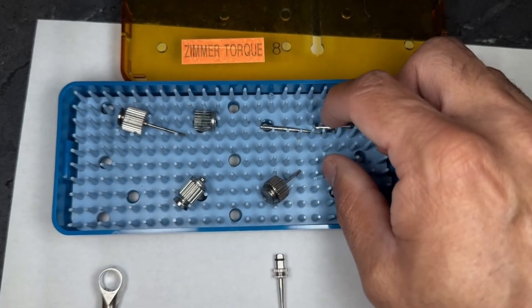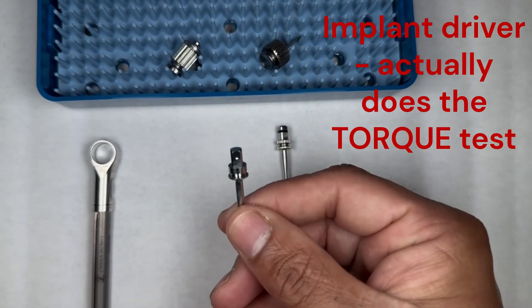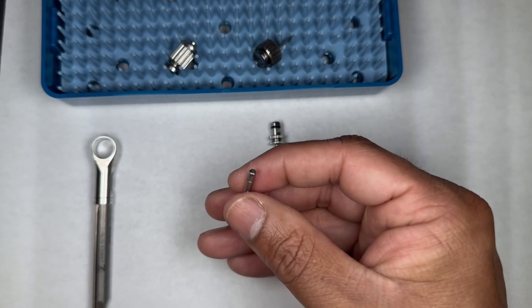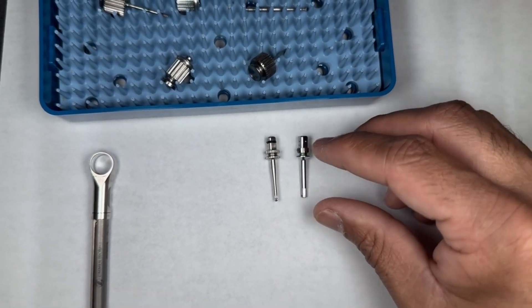The other piece that goes with the torque wrench is this one here. This is an implant driver — it goes inside the implant and is able to spin that implant. So those are our two torque drivers.